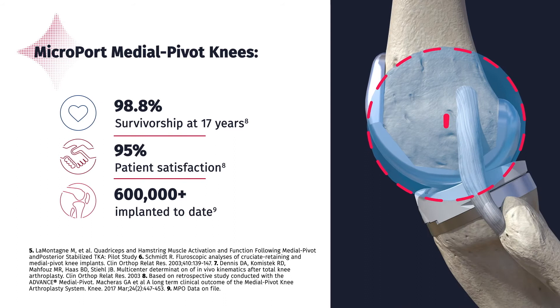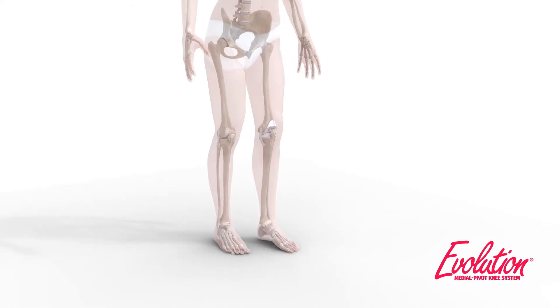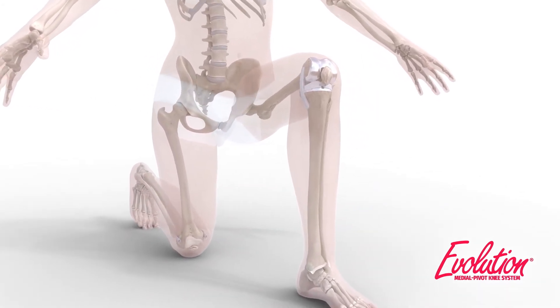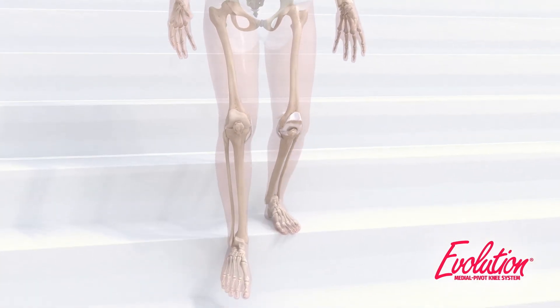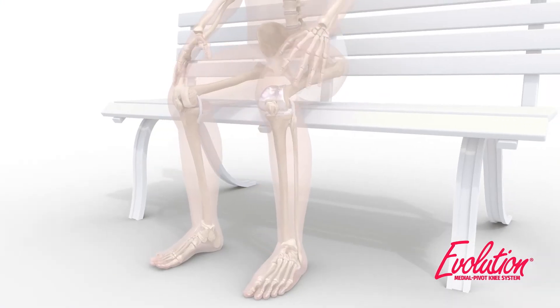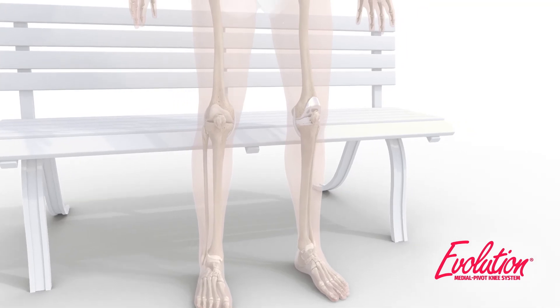It can promote faster recovery and is backed by over 20 years of clinical results. The combination of the Evolution Medial Pivot Knee with Kinematic Alignment is the latest in total knee replacement technology, allowing for a more patient-specific, anatomic total knee replacement designed to result in higher patient satisfaction.